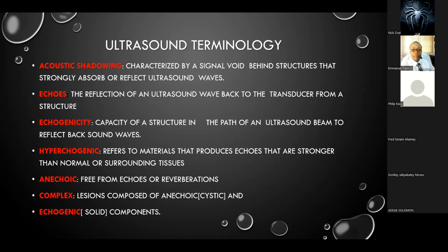So those are basically the principles and the types of various ultrasounds that we've looked at. Now we want to look at some of the terminology that is used in describing ultrasounds. And as I've said, ultrasounds always come with reports. They always come with reports.